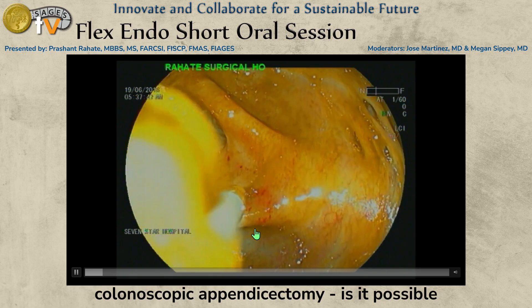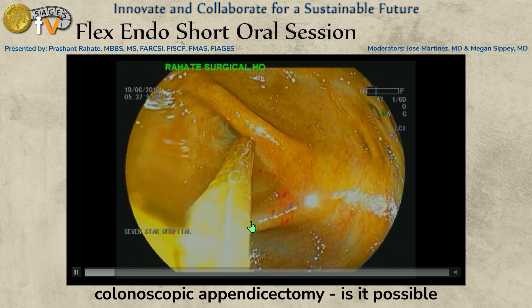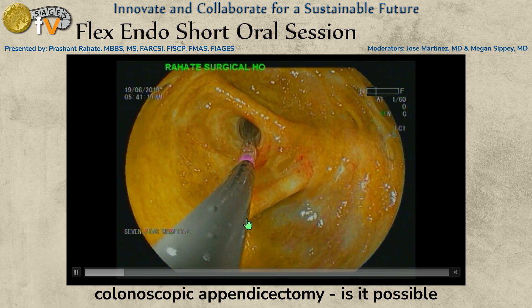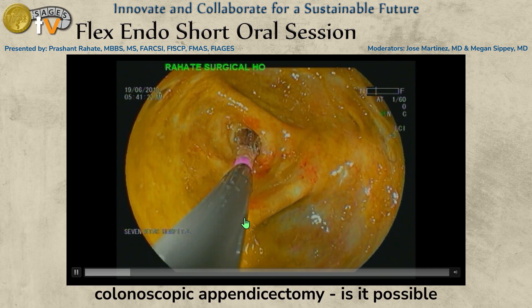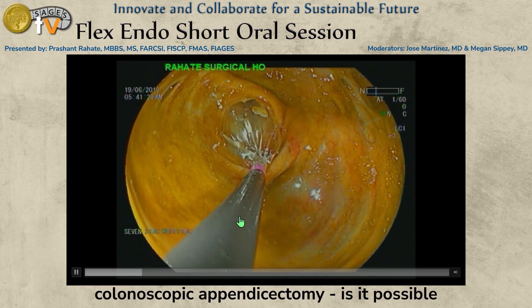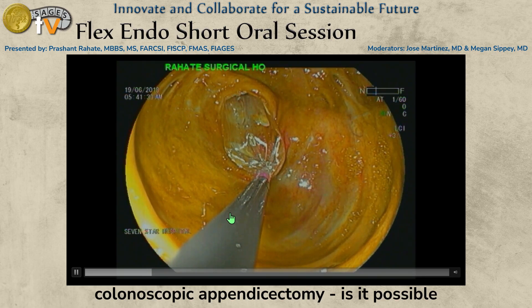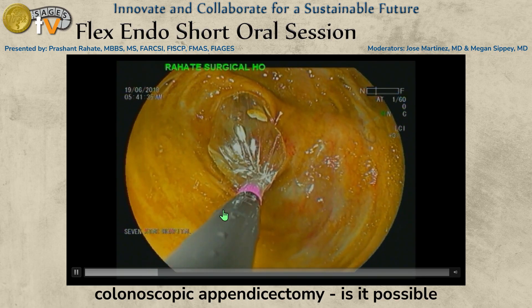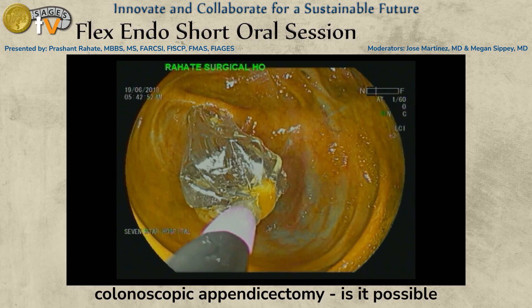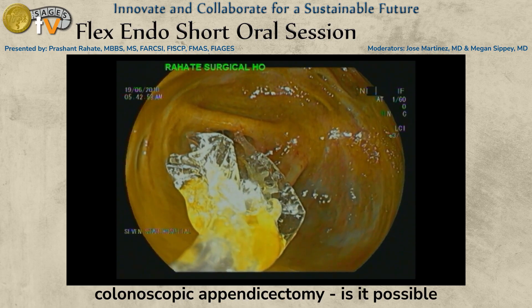We couldn't prepare the bowel. A wide ostium was seen and we dilated it with a 12-millimeter balloon. The ostial muscles have crisscross fibers which prevent retraction of the appendix, so proper dilatation at that level is very mandatory. Almost one to two minutes of dilatation, two to three times, is required. We also tried 15 or 18 millimeter balloons but those caused some trauma, so we fixed the size at 12 millimeters.